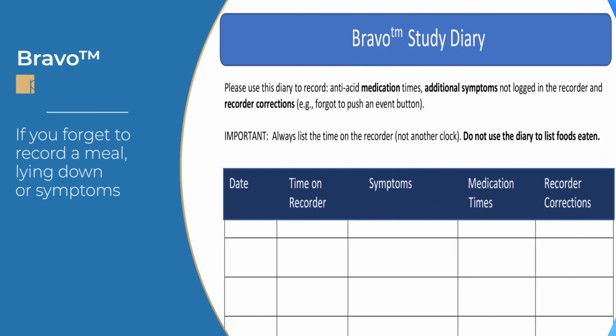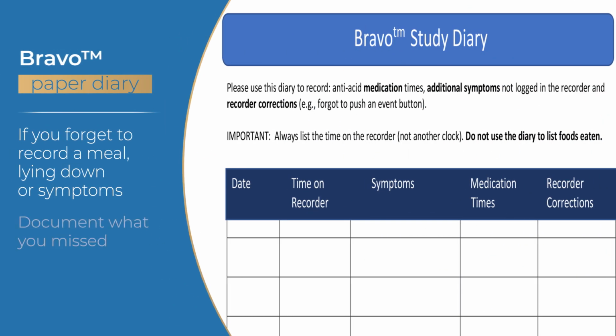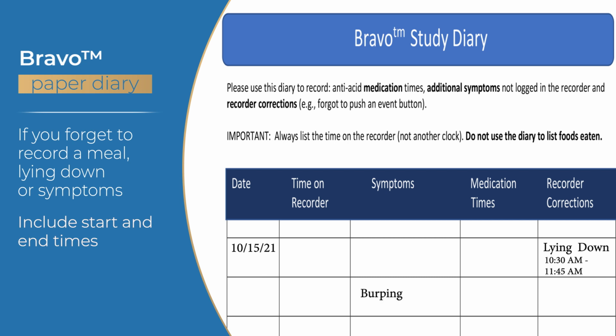If you forget to press the button for a meal, lying down, or symptoms, you should write down the information in your diary. Be sure to include the date and times. If you are experiencing any additional esophageal symptoms, such as coughing, chest pain, or burping, that haven't been assigned a button, use your diary to write down the symptom along with the date and time shown on the recorder.